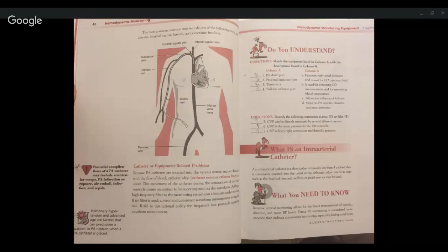Adding a high-frequency filter to the monitoring system can eliminate catheter whip. If no filter is used, correct and consistent waveform measurement is imperative. Refer to institutional policy for frequency and protocols regarding waveform measurement.